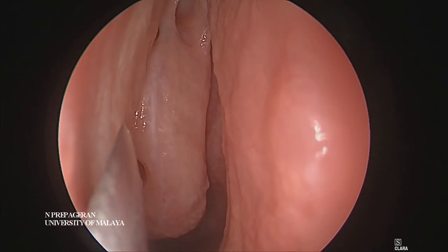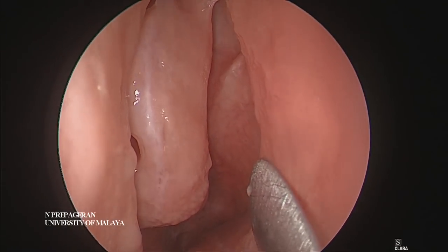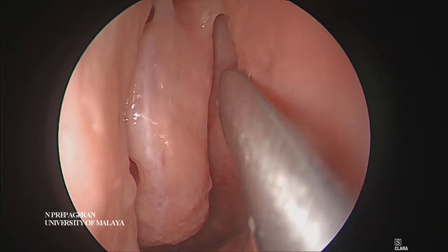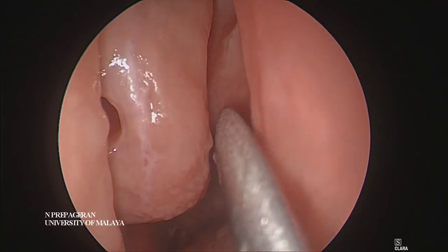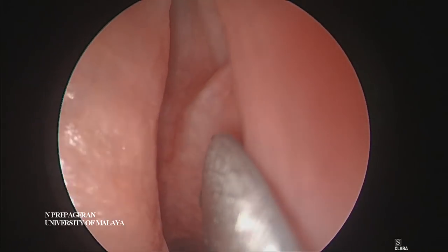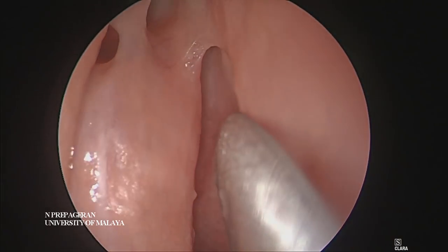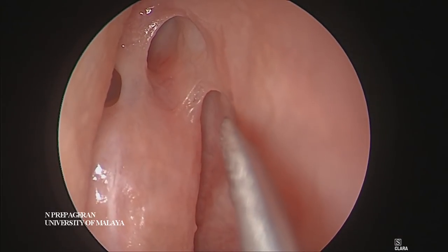So gate number one is the uncinate process. Gate number two is the bulla. Gate number three is the ground lamella, which you can see how the middle turbinate is turning laterally — the vertical as well as the horizontal portion. And again, behind the bulla you can have some space. So if there's a space behind this bulla, there'll be a retrobulla air cell. And if there's any space above the bulla, there'll be the suprabulla air cell.